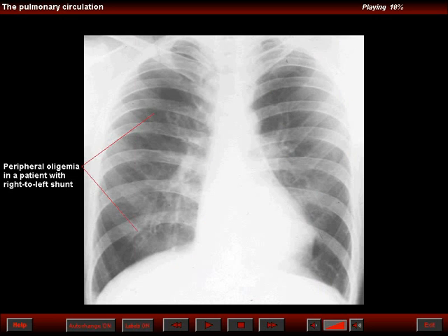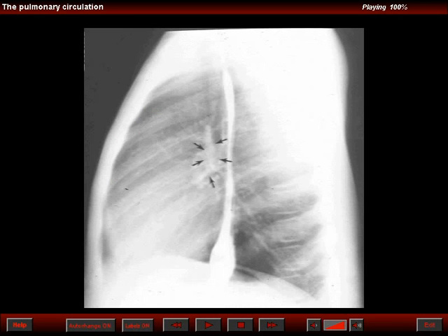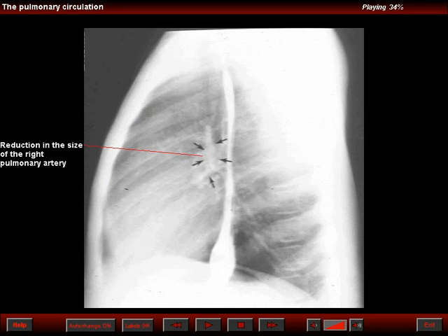Here is a patient with a right-to-left shunt. Note the diffuse oligemia in the frontal. The lateral view of the chest shows a marked reduction in the right pulmonary artery size, and this is due to shunting of blood that can be intra- or extracardiac.